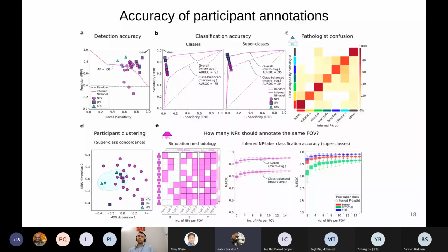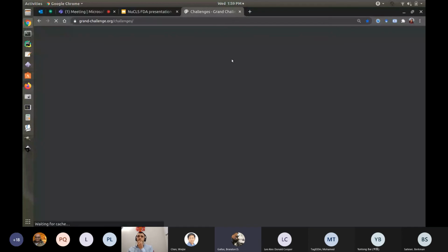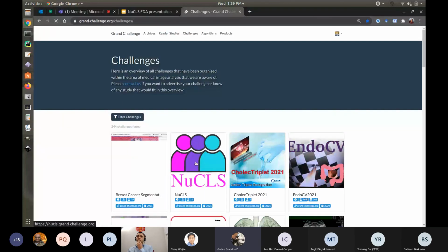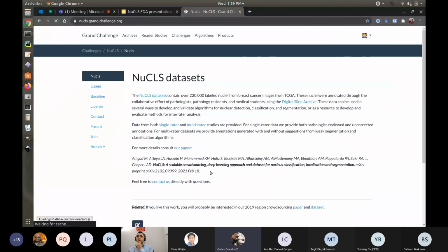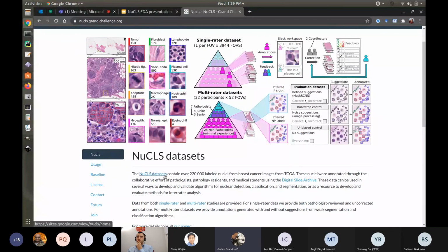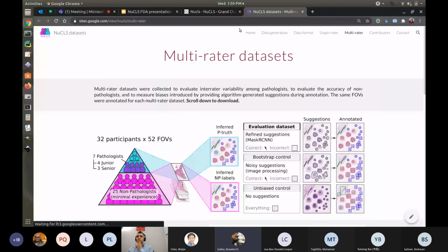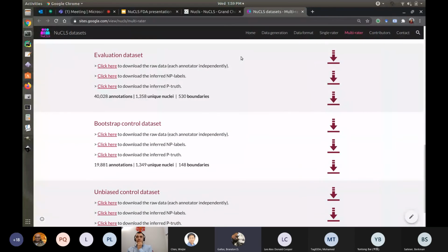But certainly, if you're going to be sharing the reader data here, there's a lot of great statistical method, not just applications, but method development that this data is just primed and ready to support. I mean, you use the word simulation in that figure, but the way you described it is not a simulation. It's not modeling and rolling the dice to come up with performance results. You are starting with 32 readers and then very randomly selecting 2 of them to see that performance.